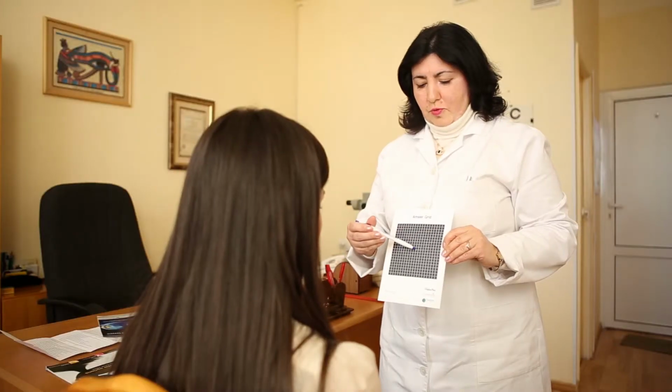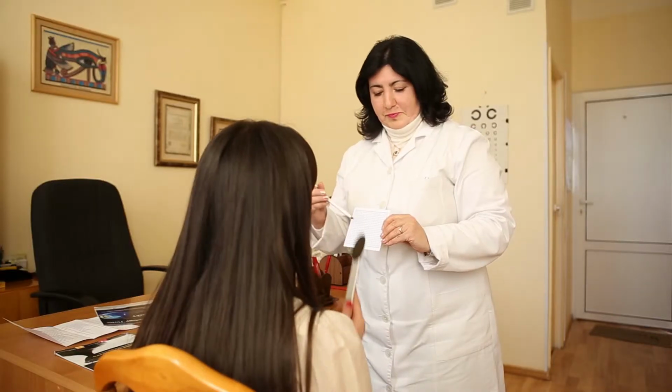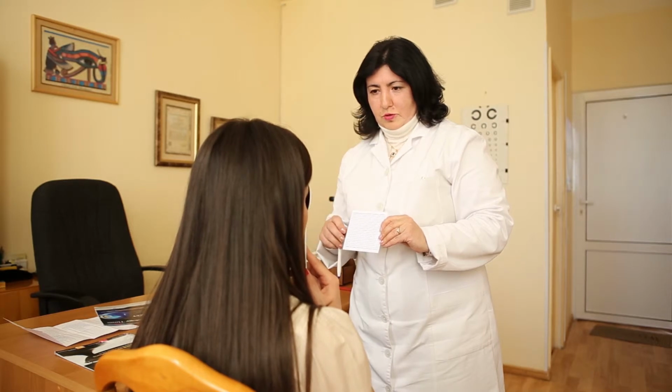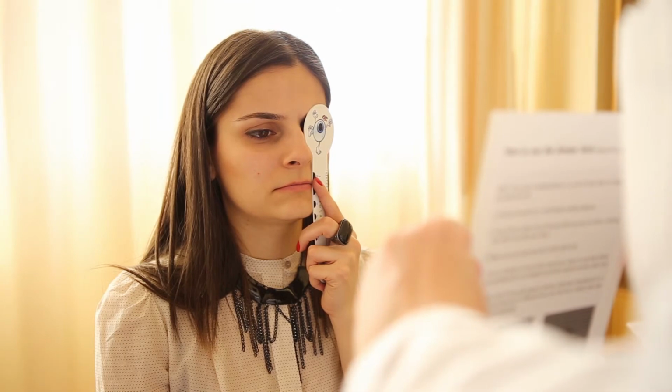The Amsler grid test is intended to reveal any abnormalities in the central area of the visual field. Have the patient hold a white on black test card approximately 16 inches away from them, with one hand covering one eye with their other hand, an occluder, or a patch.